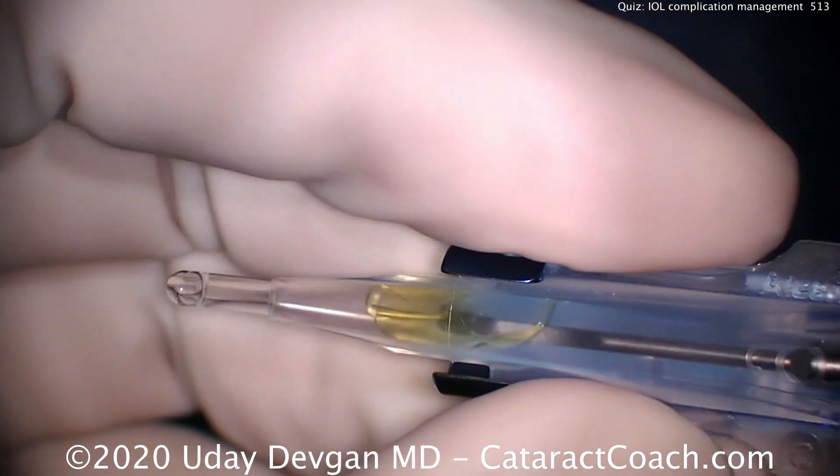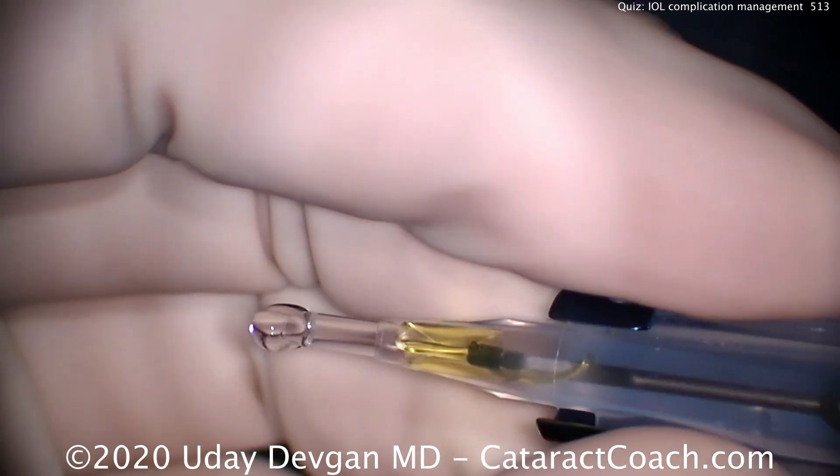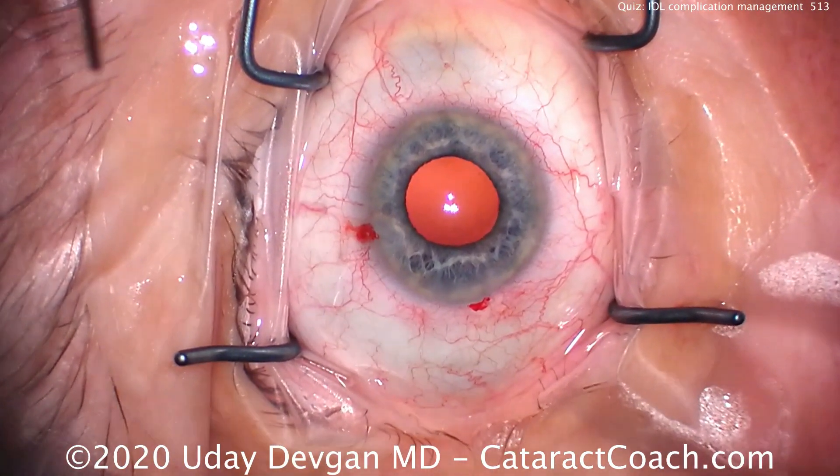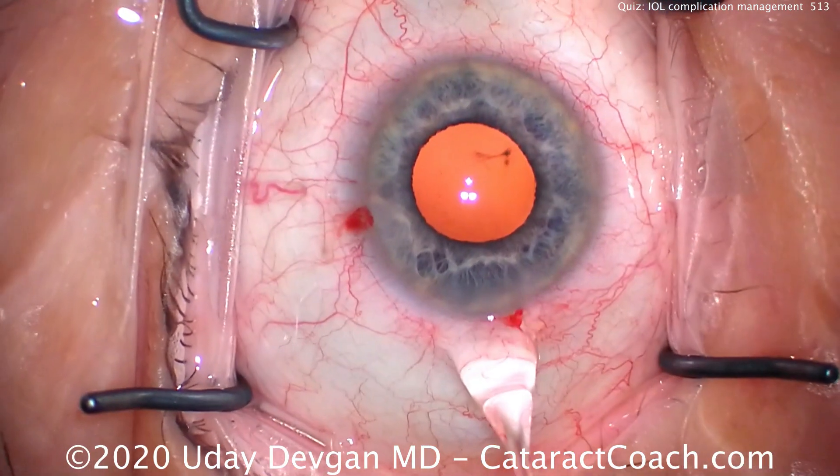As it goes down the plunger, look what happens — the trailing haptic is no longer tucked on top of the optic. That's okay, we can deal with that, and here's how we're going to deal with it.